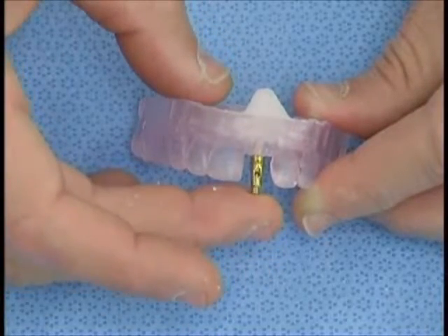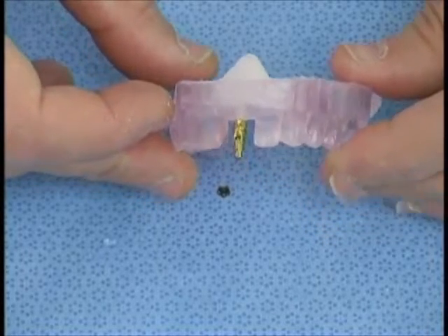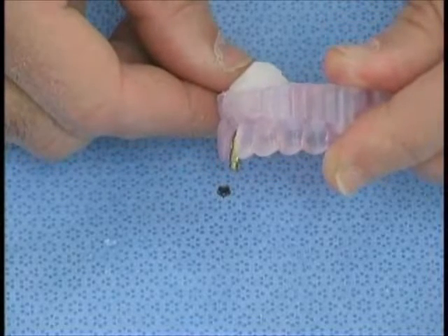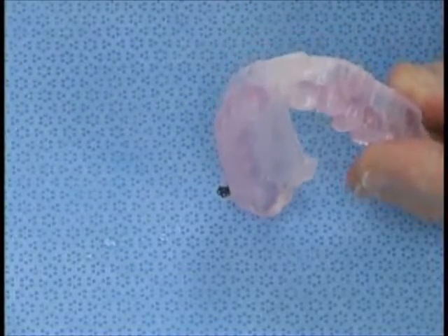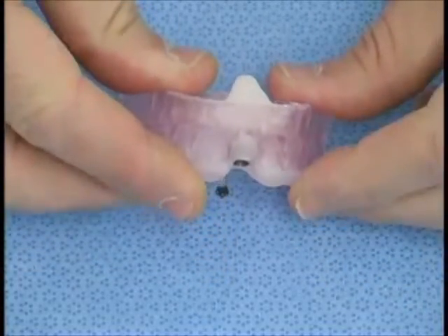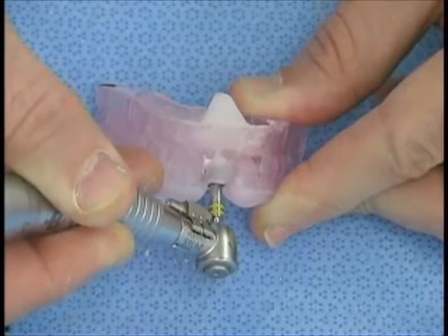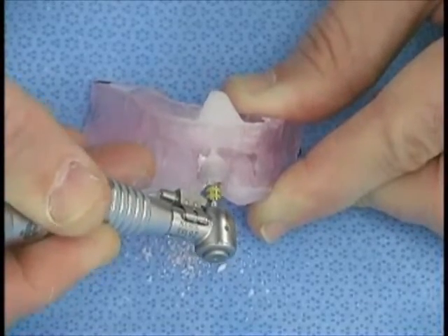So this is just as an example, just for this exercise, looking at utilizing a 15-degree angulated abutment. We're using the 3.8 guide and looking at it a little bit from the side. It's not really a true guide because it's not into the depth of the preparation, but we'll see that as we move a little bit further along. We can then move on to a wider diameter stent, you can see here. And in the same way, you can just go in and, without really having to think too much about it, take you down to the hub in this particular case.